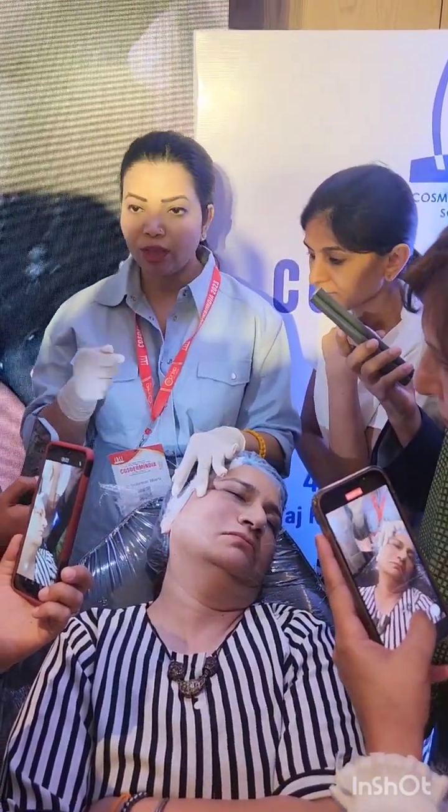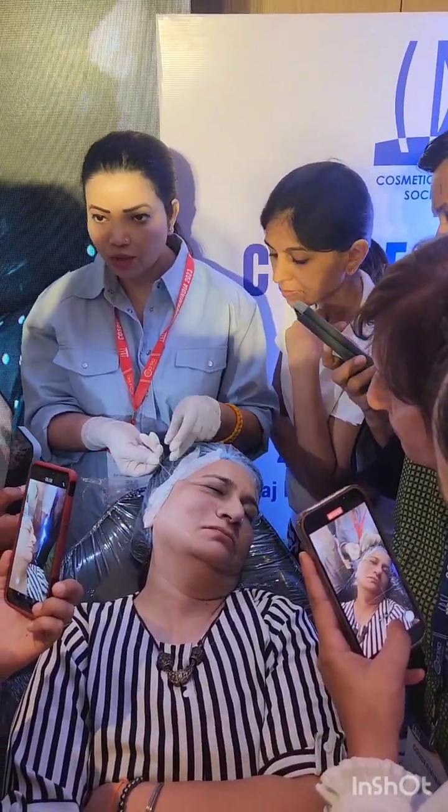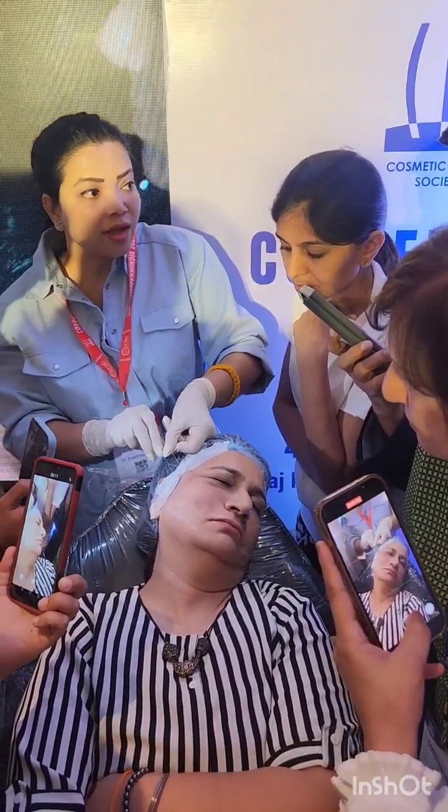Generally, what we do with the artery forceps, you twist it, and you twist it over here. The pressure you should feel here. Okay?